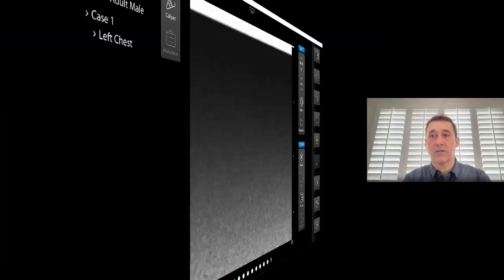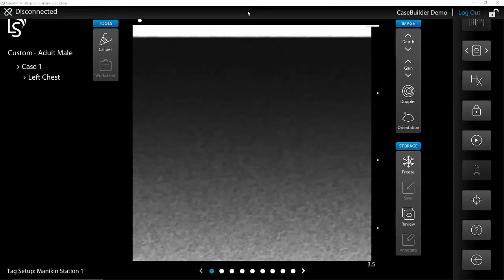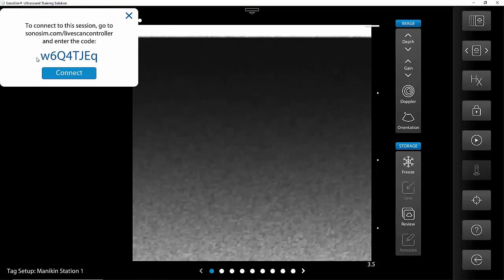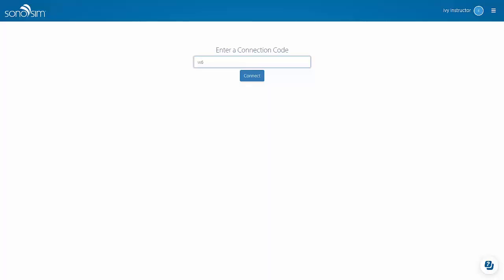Here, what we're going to illustrate, in addition to what we talked about, is here it shows that you've put in a web code. And by putting in that web code, you can have any web-enabled device, whether it's a mobile phone in this example, or a laptop computer.